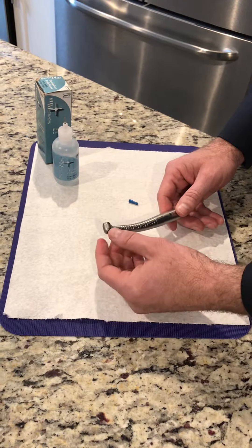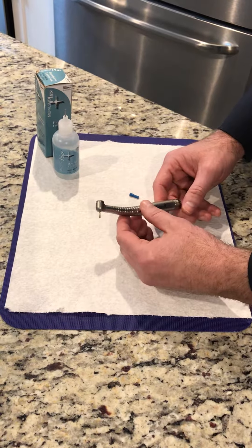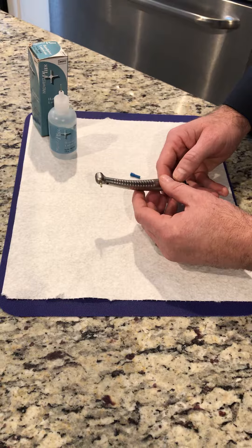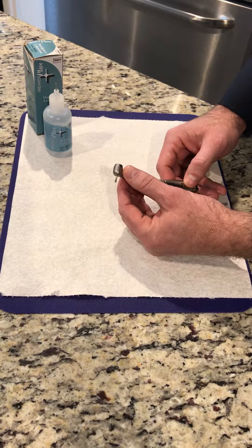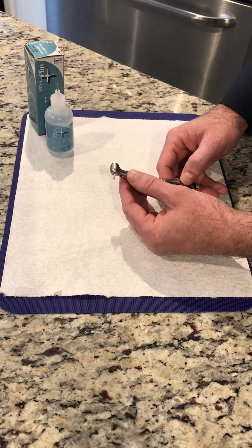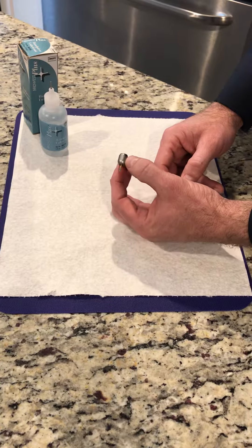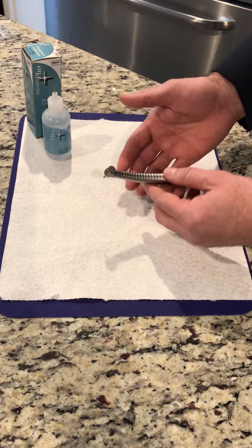Every once in a while you'll have a burr stick in an older handpiece, or sometimes even a new handpiece. One of the quickest ways to get the burr out is to use a technique where you're going to release it from the chuck. Sometimes when we put a lot of load or pressure on a burr, it can do a very quick pseudo-weld inside the head, but we can release that with the push button.